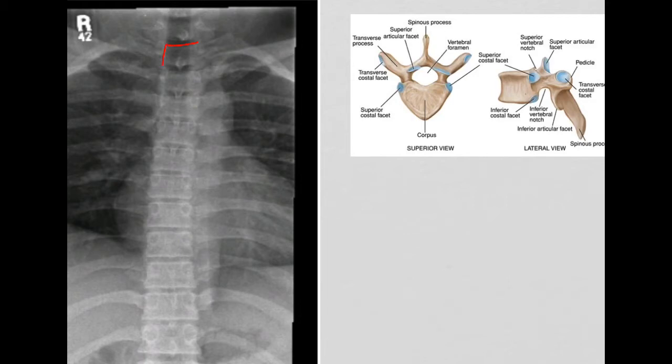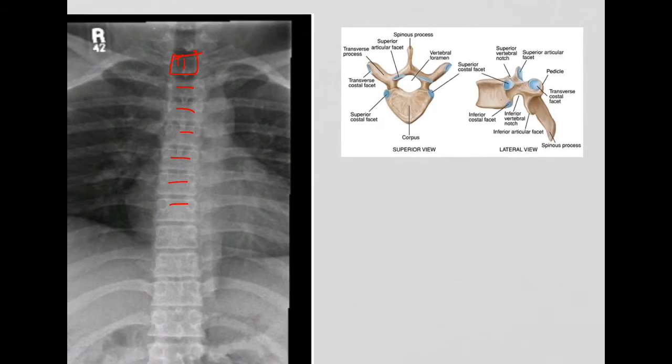Let's go back to our vertebral bodies. We said that this was T1. Let's count to make sure. There's T2, 3, 4, 5, 6, 7. Let's go back out.